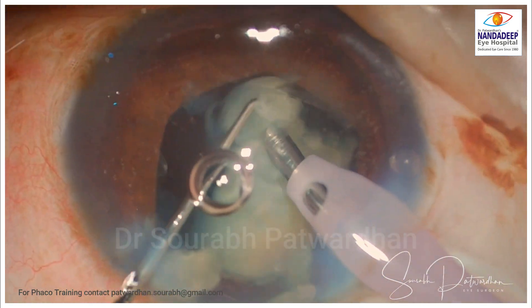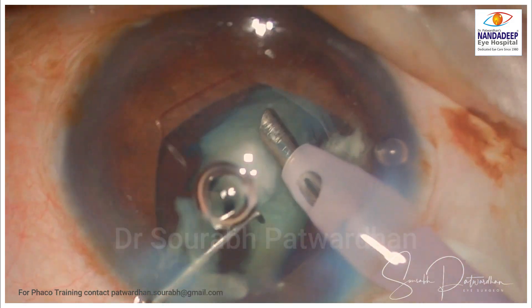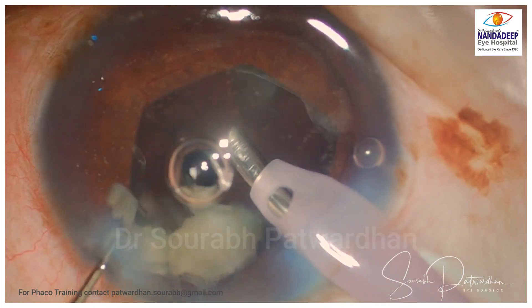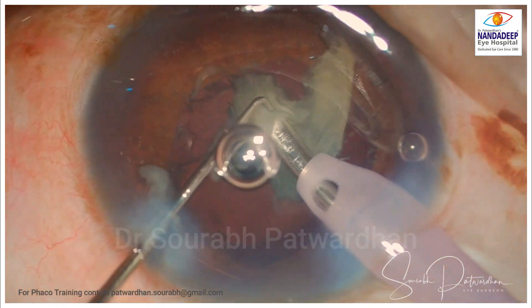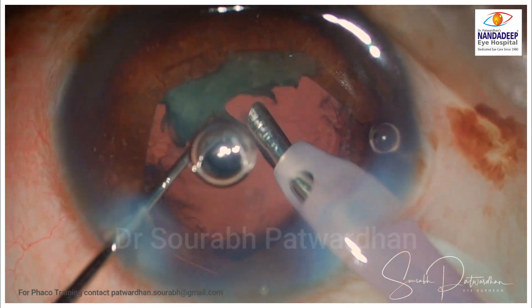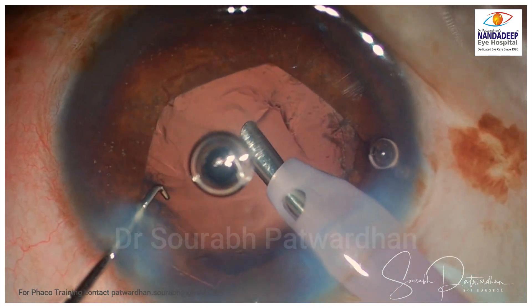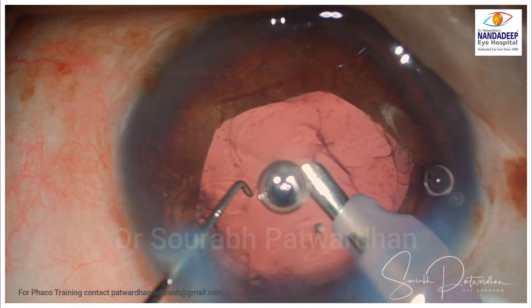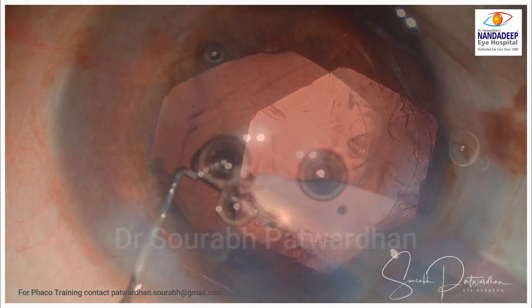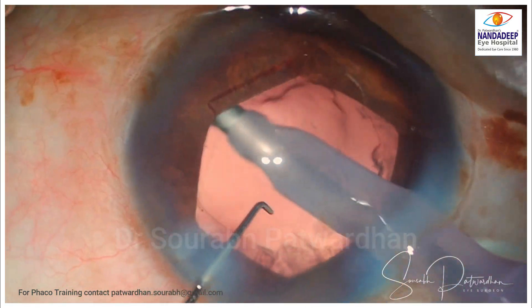As I go near the last piece, I will shift to retroillumination mode just to watch the posterior capsule. If it is fluctuating, I am going to reduce the vacuum and flow rate so that you have a stable anterior chamber for the last piece. You can see the posterior capsule is very well stable. Once you have chopped pieces, it is like stand and deliver — just keep the phaco tip right at the center and keep delivering power in bursts while your left hand maneuvers the pieces around.